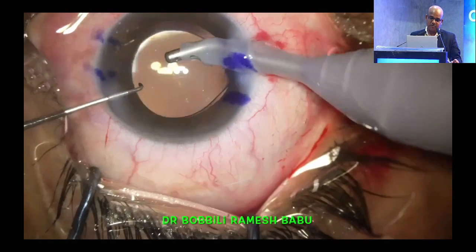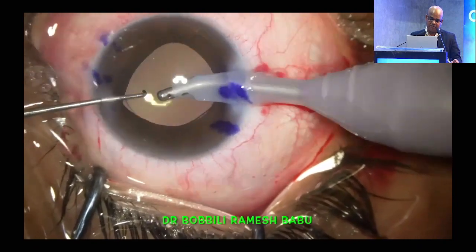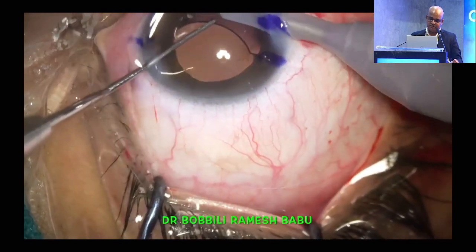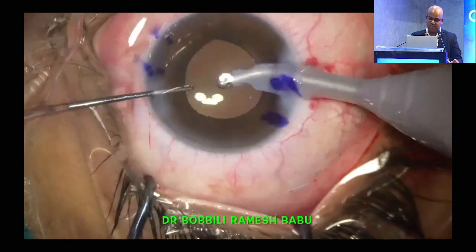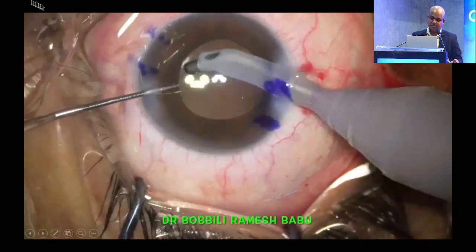After removing the viscoelastic from anterior and behind the IOL, the IOL is rotated to the required position. The viscoelastic is being removed from behind the IOL. Now you can see the lens is done.